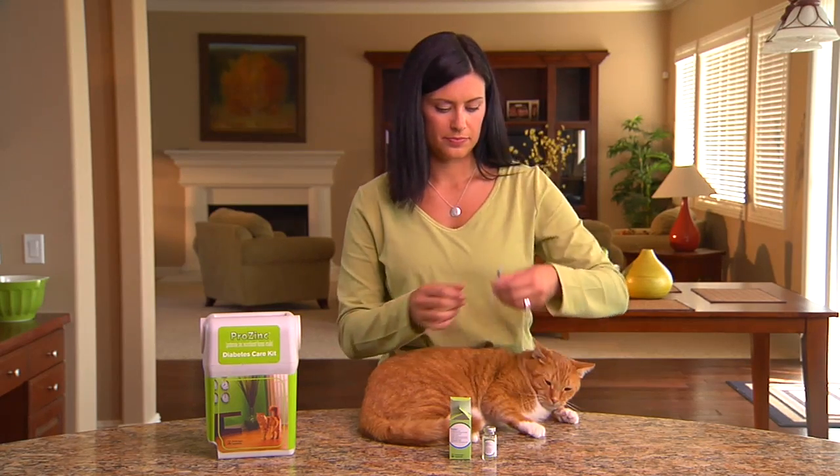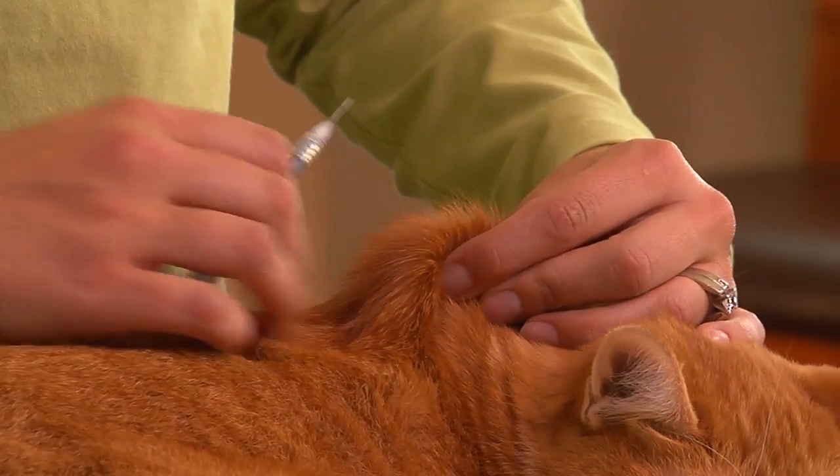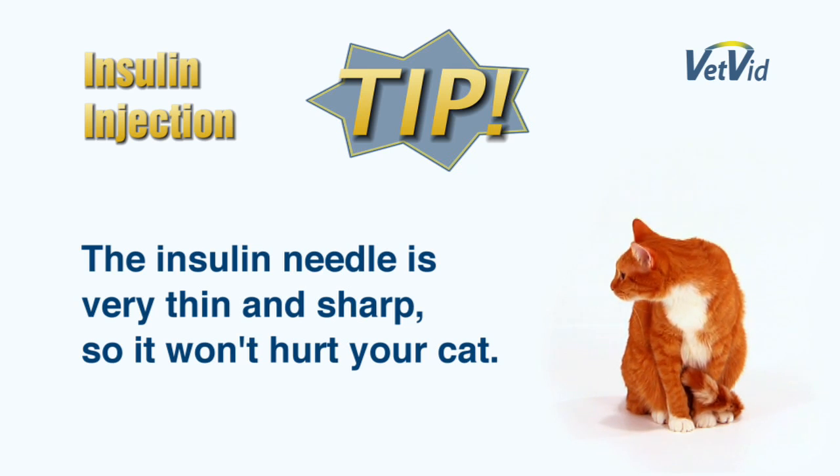While you're petting your cat, gently pull up a fold of skin at the spot you've chosen, like Lisa's doing. Now quickly insert the needle into the fold of skin. The insulin needle is very thin and sharp, so it won't hurt your cat, especially if you insert it quickly.